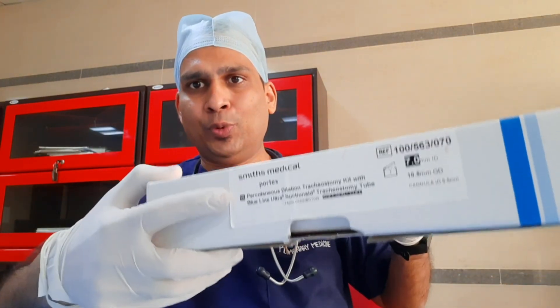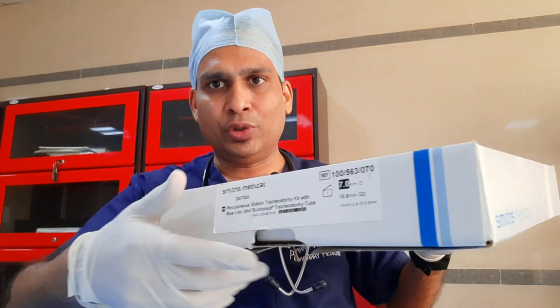Good morning friends, today we will see a live procedure of percutaneous tracheostomy. Before proceeding to the procedure, I'll introduce its instruments. This is Portex tracheostomy 2, which we are going to use.